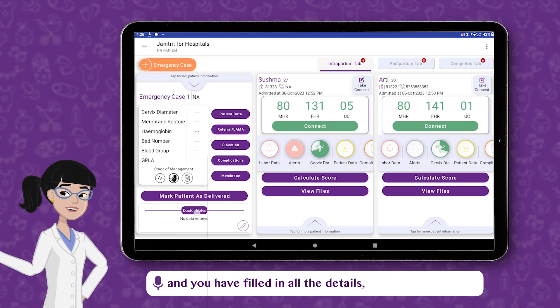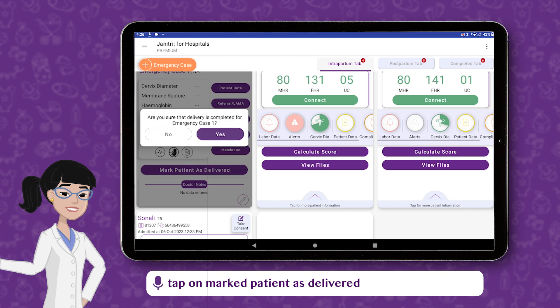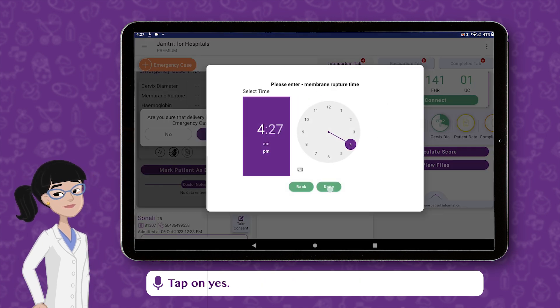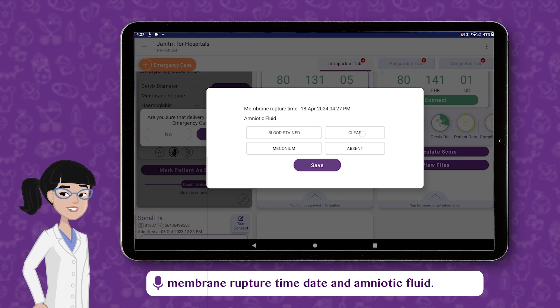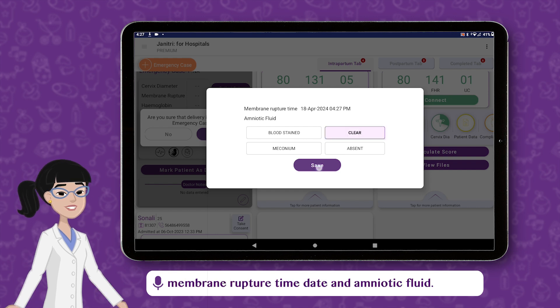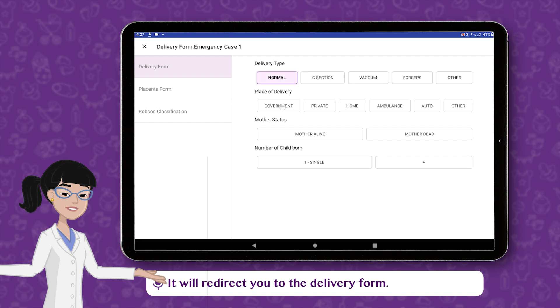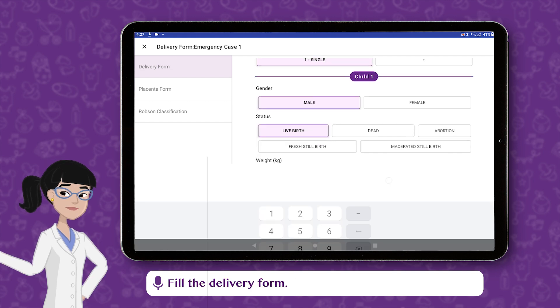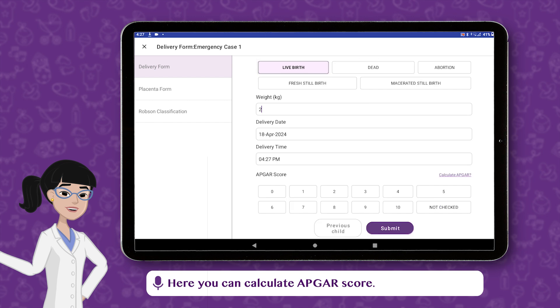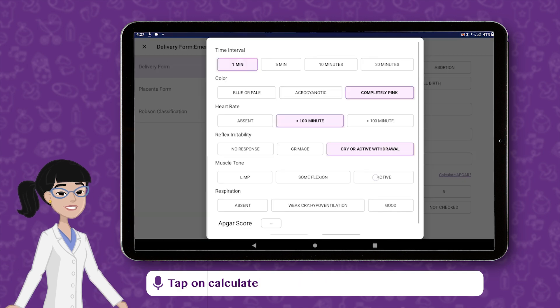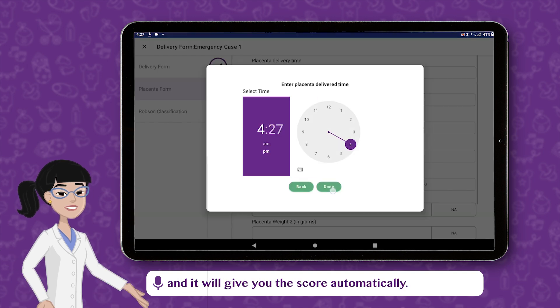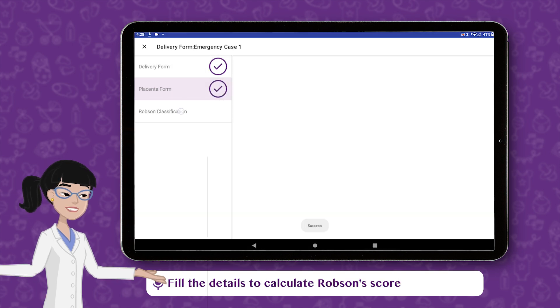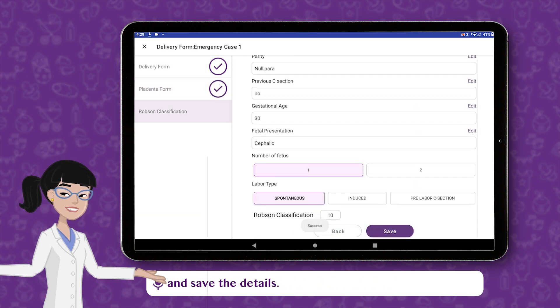If the patient has delivered and you have filled in all the details, tap on Mark Patient as Delivered and it will ask if the patient has delivered. Tap on Yes. If delivered, it will ask you Membrane Rupture Time, Date, and Amniotic Fluid, then redirect you to the Delivery Form. Fill the Delivery Form. Here you can calculate the APGAR score — tap on Calculate APGAR, fill in the details, and it will give you the score automatically. Fill the placenta form and fill the details to calculate Robson's score, then save the details.